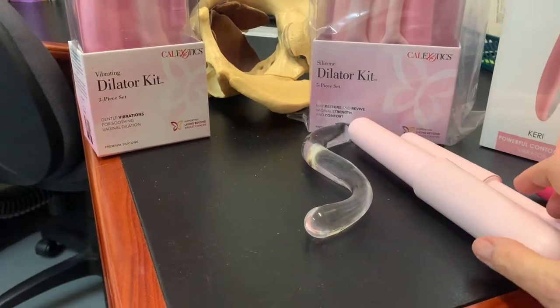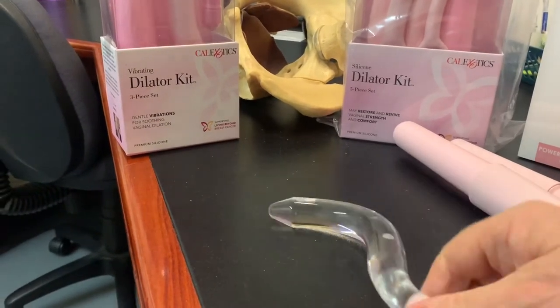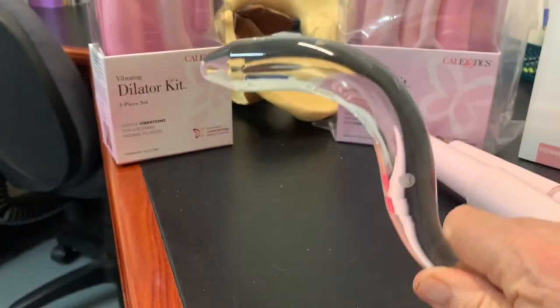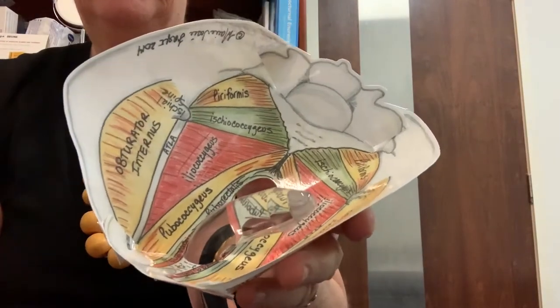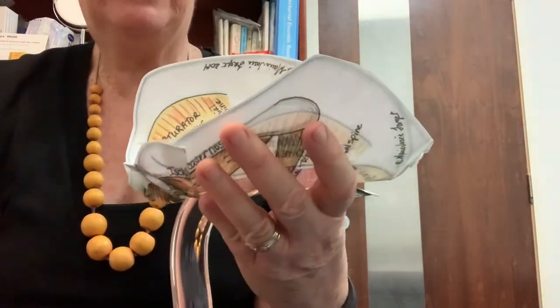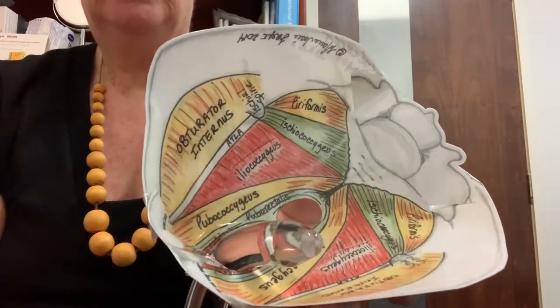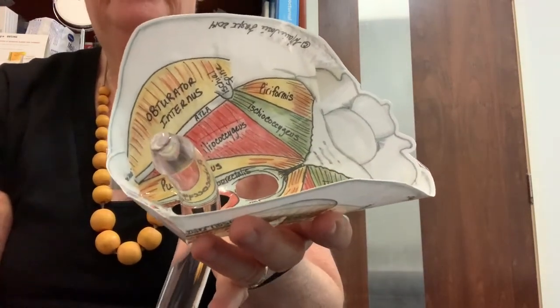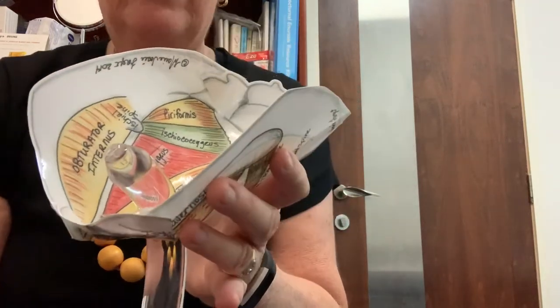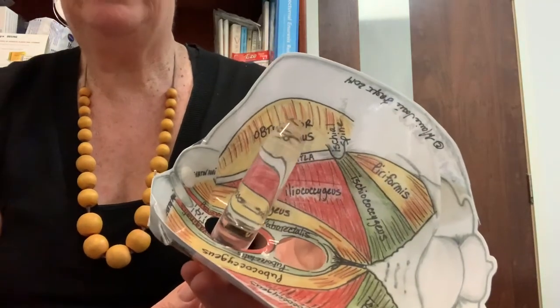The second dilator that we use a lot is called a wand. If you've got the dilator held here, you can do a lovely sweeping action with the wand. If you find a tender area then you can do some holding action there. Here you can see I've put the dilator in through the vagina and we're finding the muscles — we've got puborectalis and pubococcygeus here — and we can do a rolling action along the muscle, and then turn it around and do a rolling action along the muscle. We can then go further out to obturator internus, which is quite a deep muscle and commonly a source of pain, going on to that muscle on one side and then around to the other obturator internus muscle.